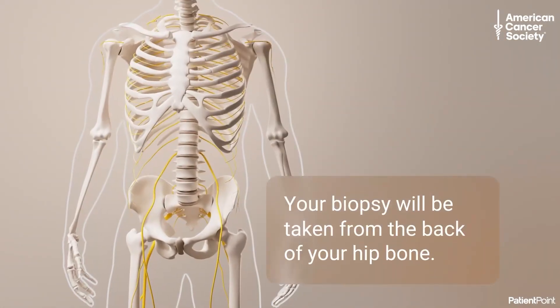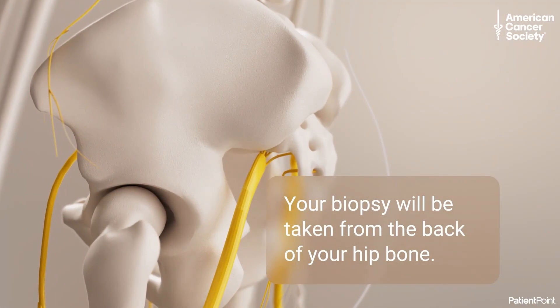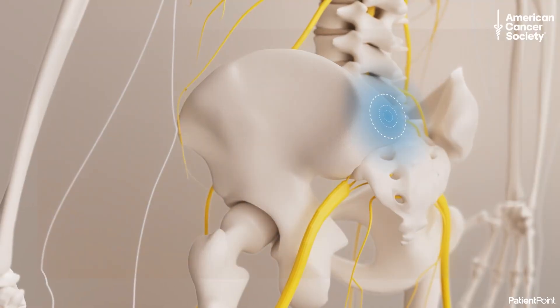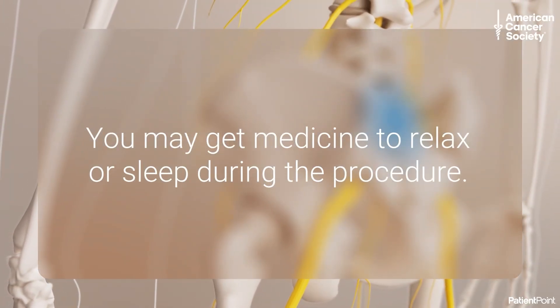Your bone marrow biopsy will probably be taken from the back of your hip bone, where there are no major nerves. Before your biopsy, your doctor numbs the area, but you may still feel some discomfort. You may also choose to get medicine that helps you relax or stronger medicine to make you sleep during the procedure.